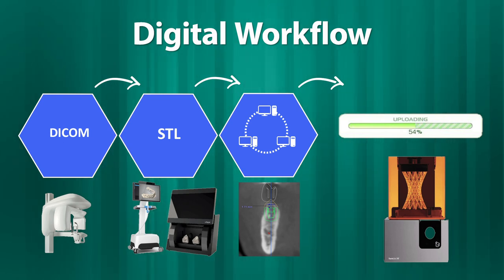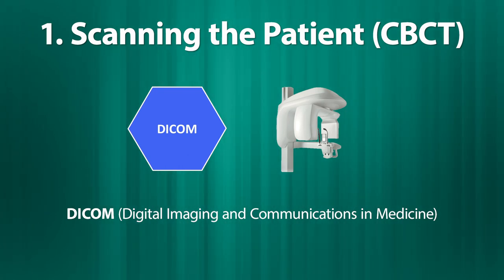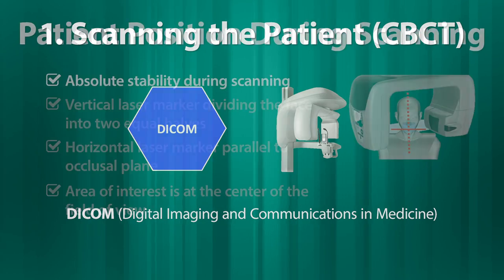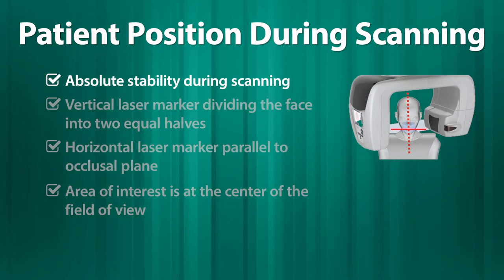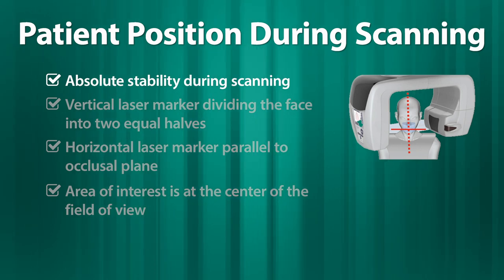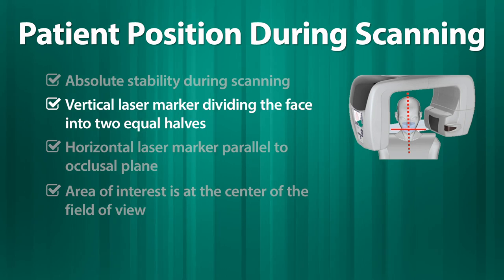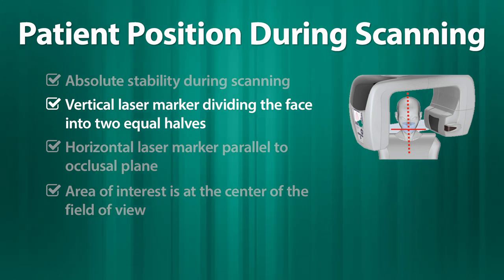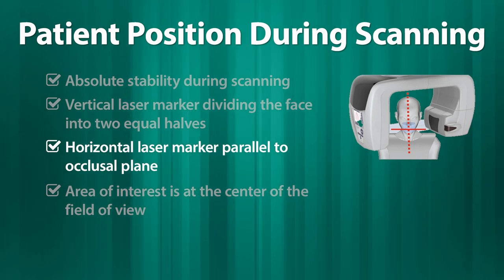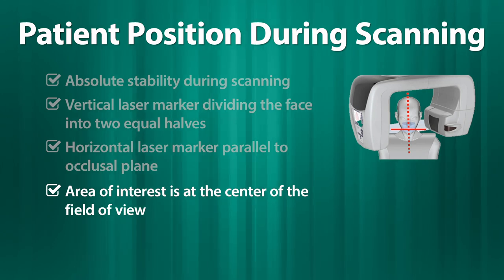As we discussed, the first step after clinical examination is requesting a CBCT for the patients. There are certain requirements for patient position during taking the CT. As all of you know, it's very important to have absolute stability of the patient during scanning. Also, the vertical laser marker should divide the face into two equal halves, while the horizontal laser marker should be parallel to the occlusal plane. Finally, the area of interest should be at the center of the field of view.